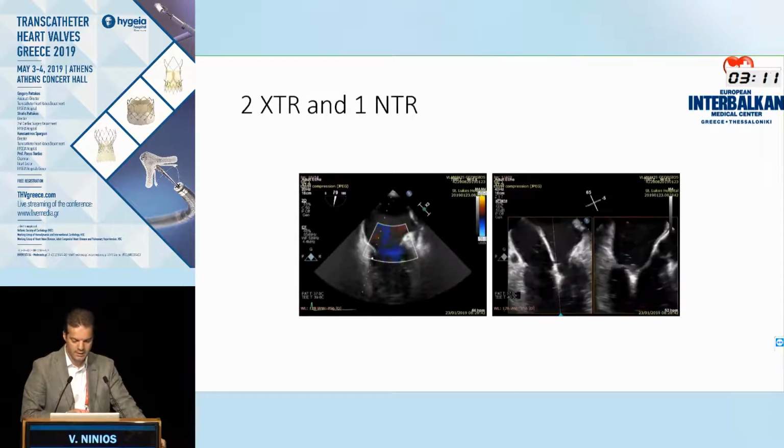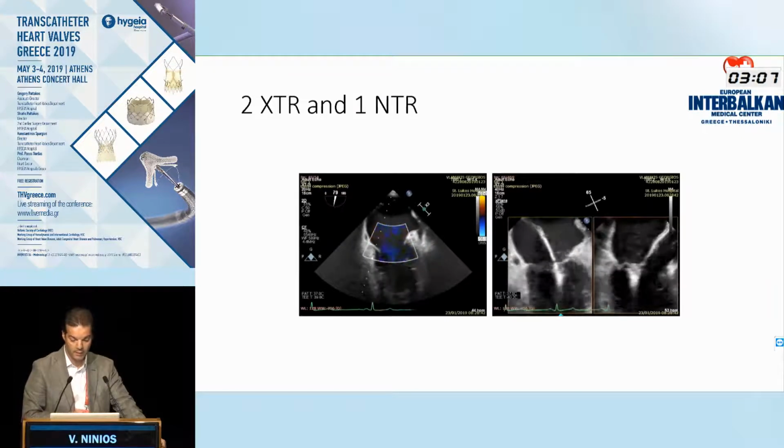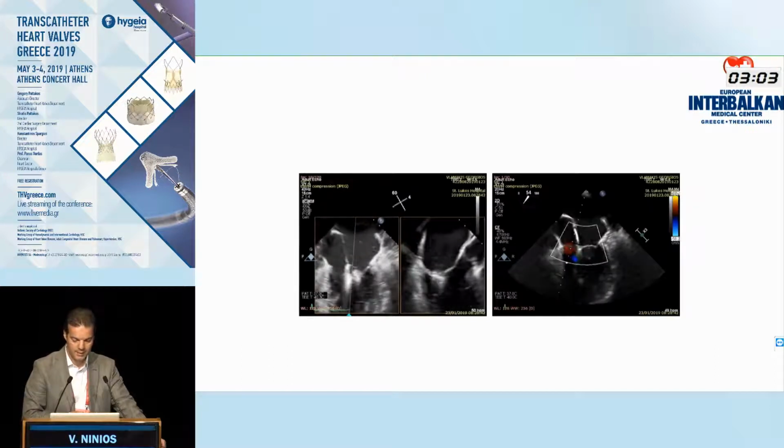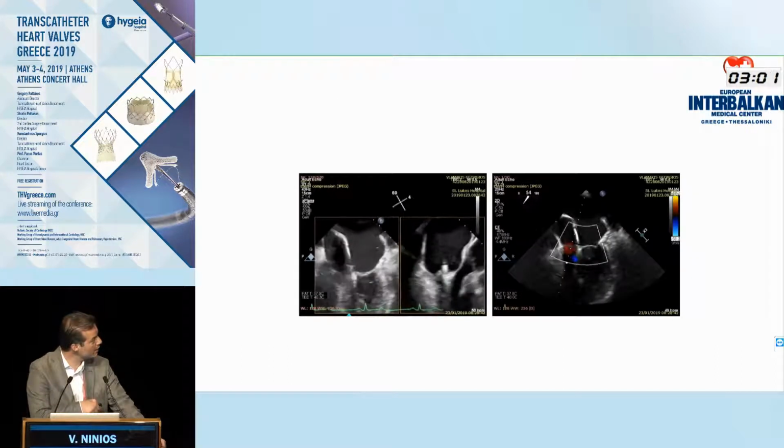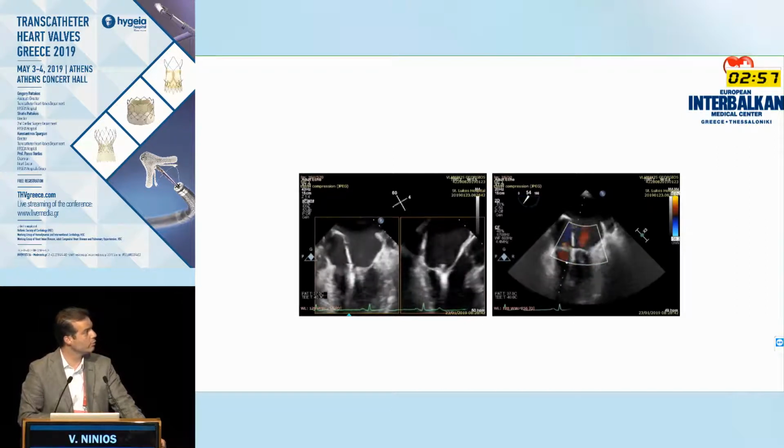So we started zipping this valve, this P2, by putting 1 XTR that we managed to actually grasp lateral here. Medial was not easy. Then we put a second one just medial to that, as you can see, as a body clip, and we had an acceptable result.